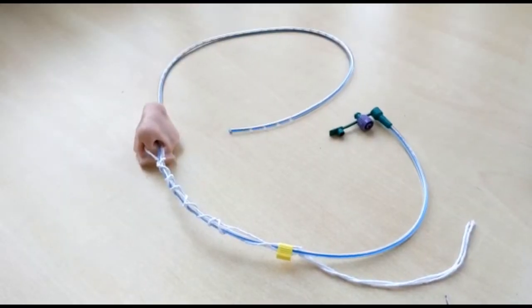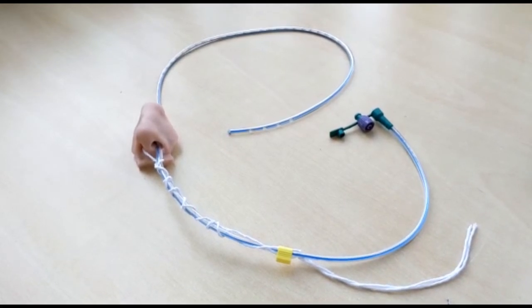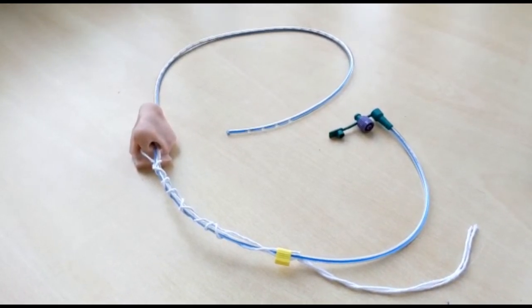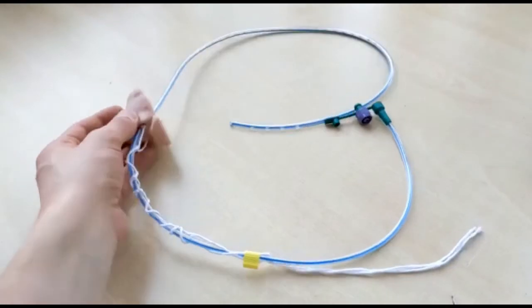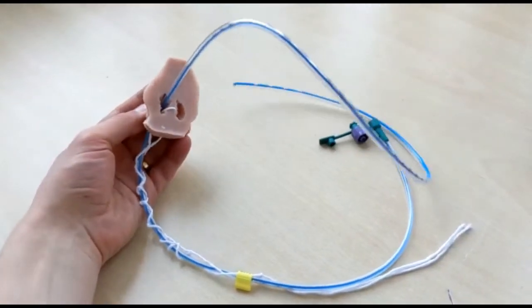Keeping nasogastric feeding tubes securely in place is essential in critical care. Bridling the feeding tube with the CoreGrip bridle kit works by anchoring the tube on the vomer bone with string.